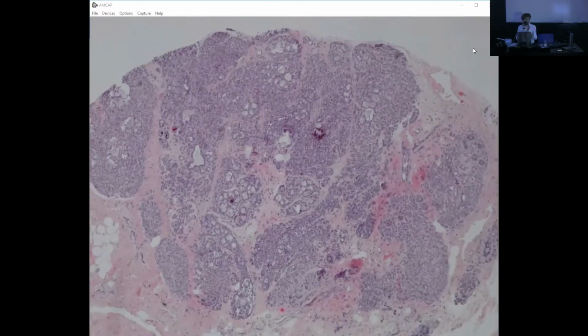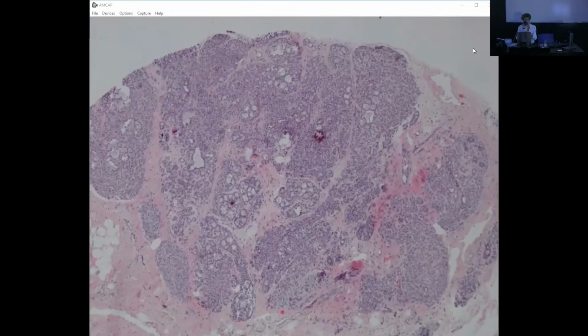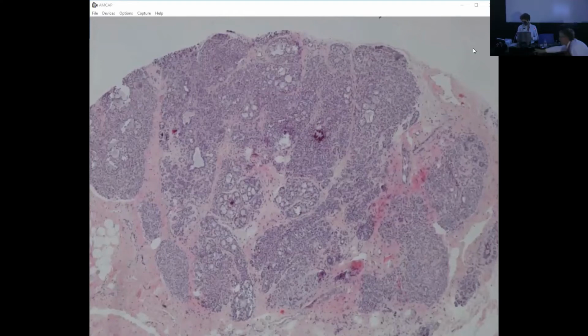I have a comment. How frequent are these cases of collagenous spherulosis? You have shown us a large series of cases. So I'm thinking about how many I missed in my reports. I think they are more frequent than one can think. It's rare to have this much volume of LCIS and collagenous spherulosis forming, this is probably a 0.5 centimeter lesion, right? But they are common, and I've seen a number of cases misdiagnosed as DCIS. That's my experience.